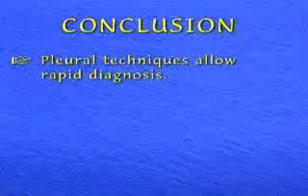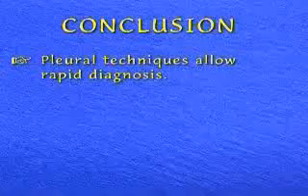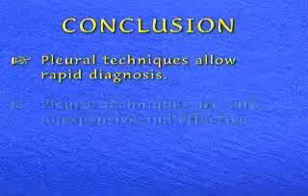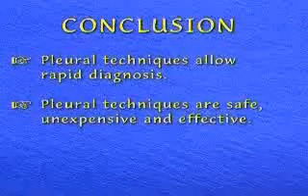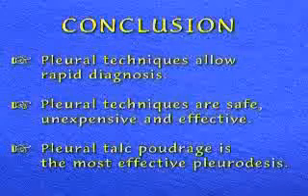With proper training and adequately designed equipment, pleural procedures allow safe, quick, and accurate diagnosis in most cases. Talc poudrage has proven to be a much simpler, safer, and more cost-effective method for pleurodesis than chemical techniques.